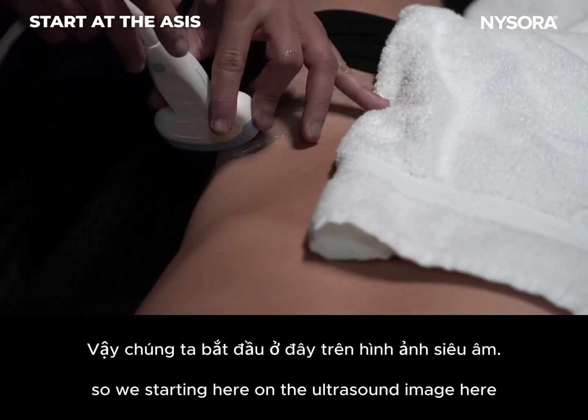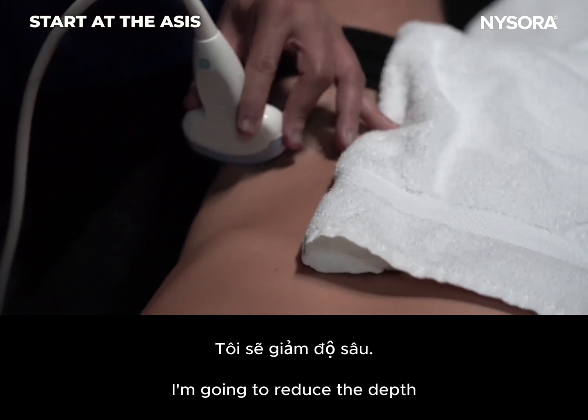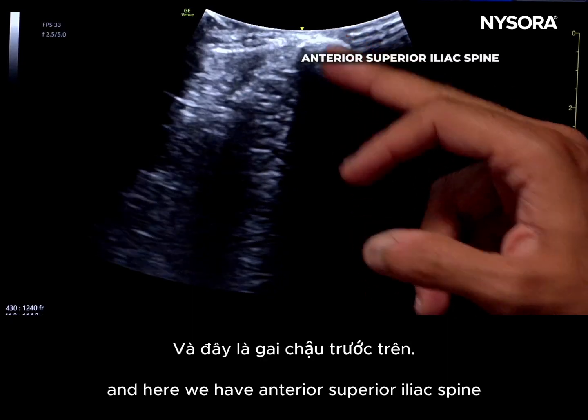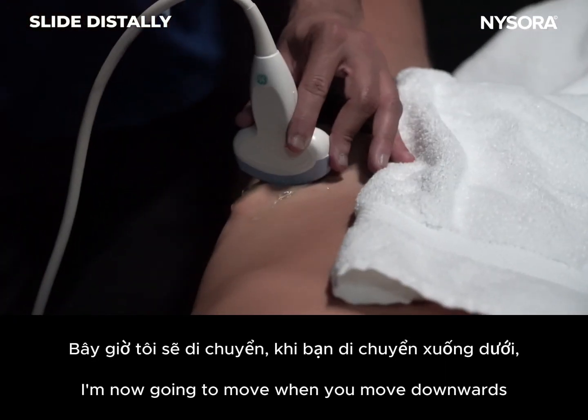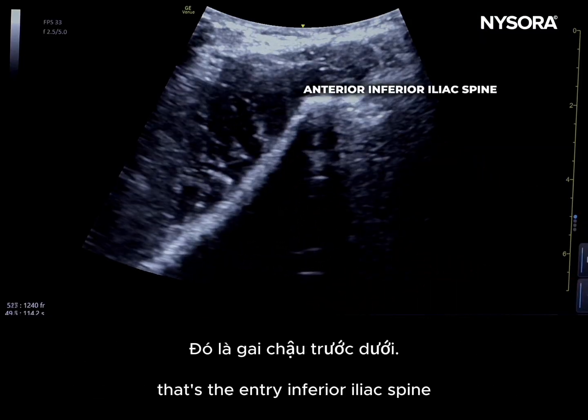So we're starting here on the ultrasound image. I'm going to reduce the depth. And here we have the anterior superior iliac spine. I'm now going to move. When you move downwards, you will have another structure coming into the image. That's the anterior inferior iliac spine.